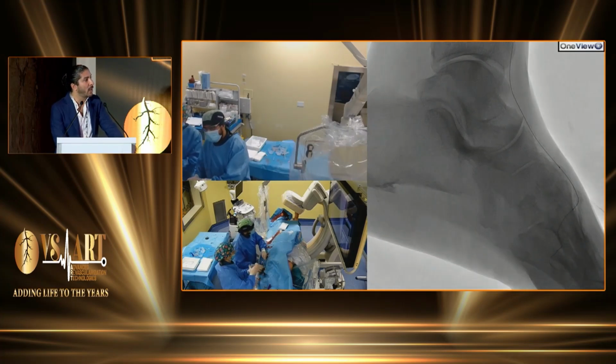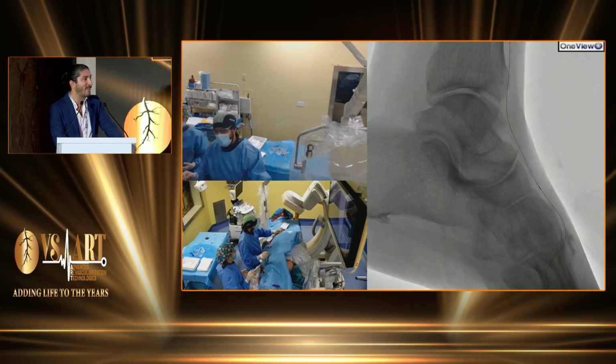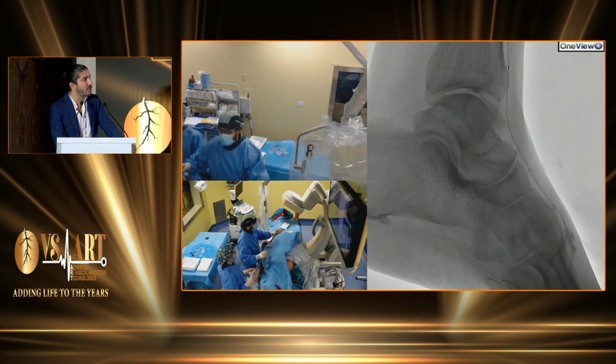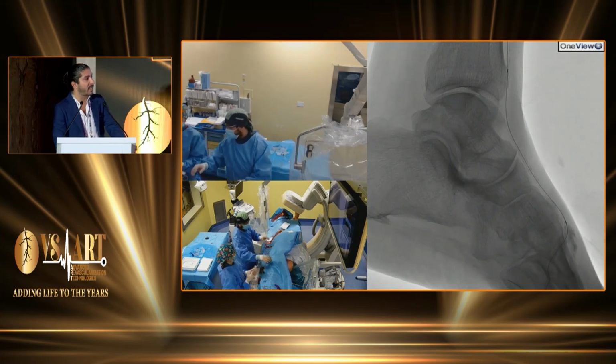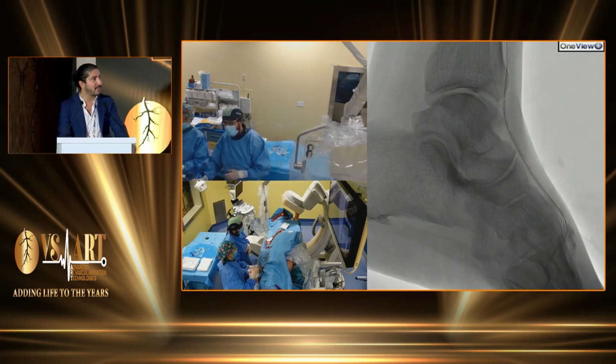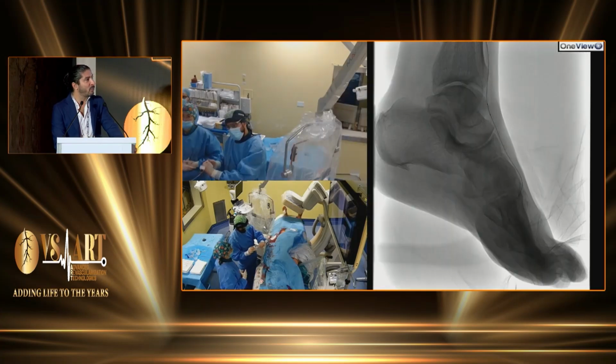For sure, with all the elements we have today to treat calcified arteries, we must first cross the lesion and pass the guide wire. So we need for sure the support of technology, with the new generation of guide wires that in most cases allow us to cross, as well as the support from the industry to treat these arteries, or creativity to be able to open those arteries properly.